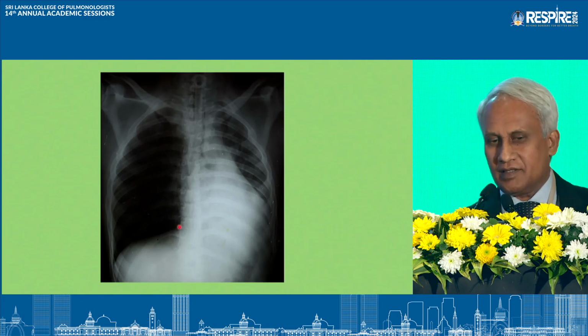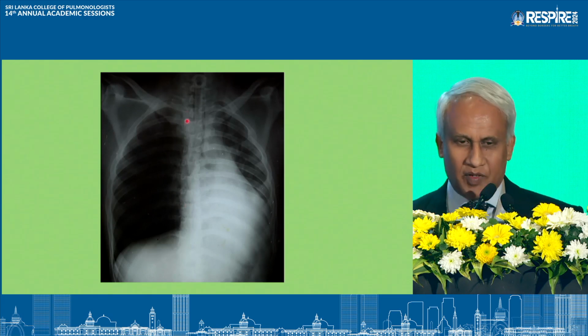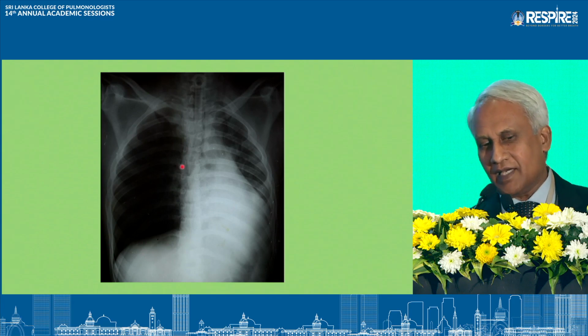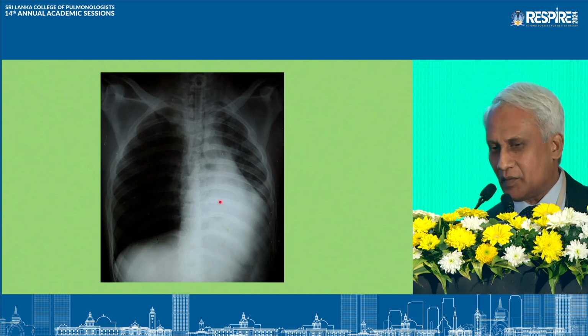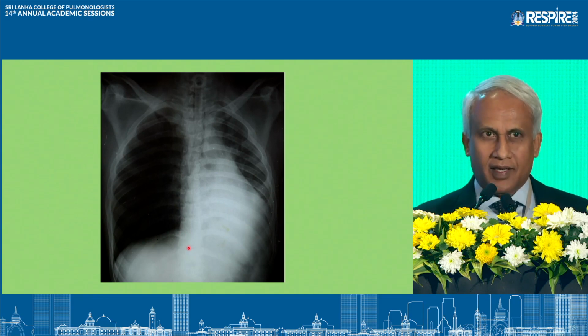Another patient, ICU patient, you can see this is an inward AP film, and if they become suddenly hypoxic, do an X-ray. Now we can see the shifting of the cardiac shadow this way, and there is behind the heart opacity. So in this case, you are supposed to do bronchoscopy and see.